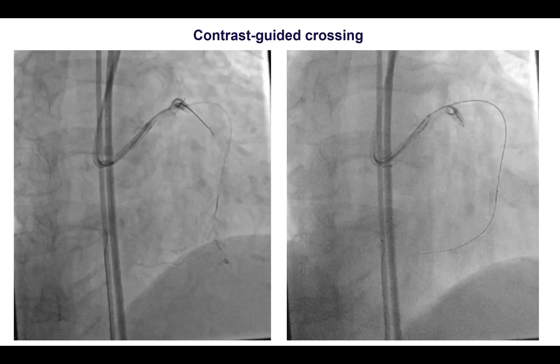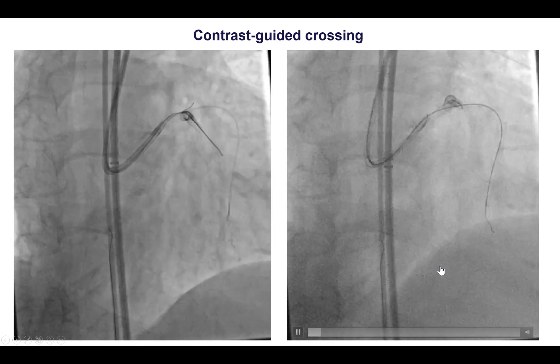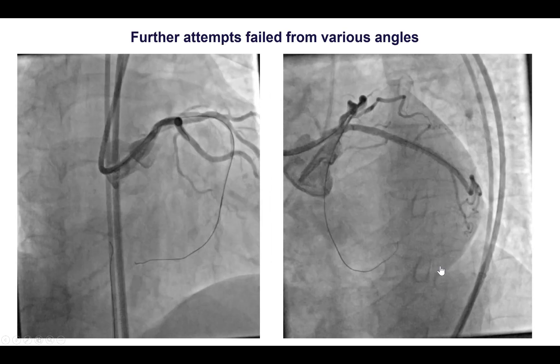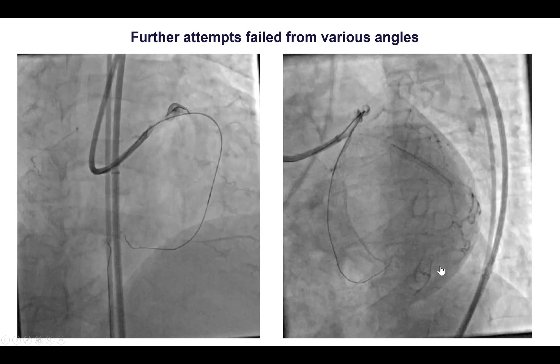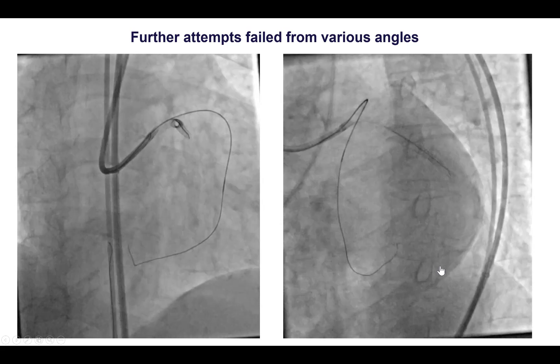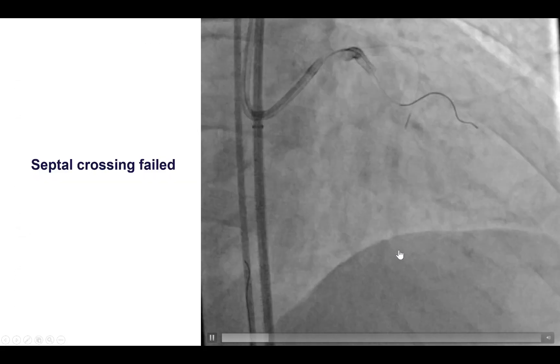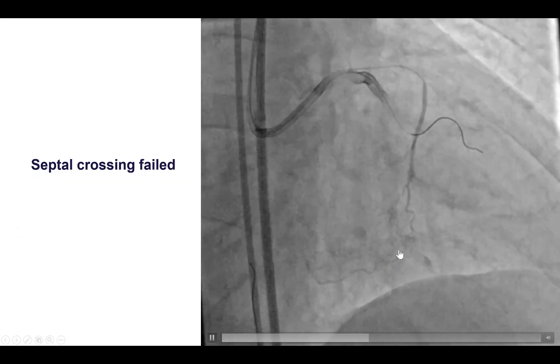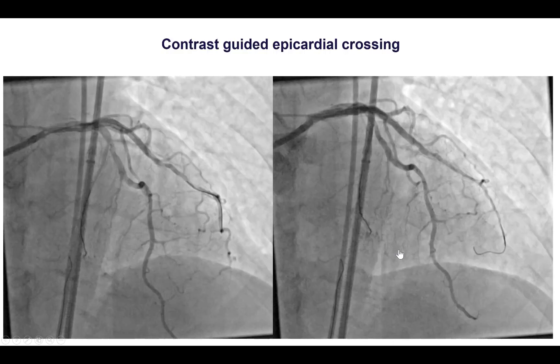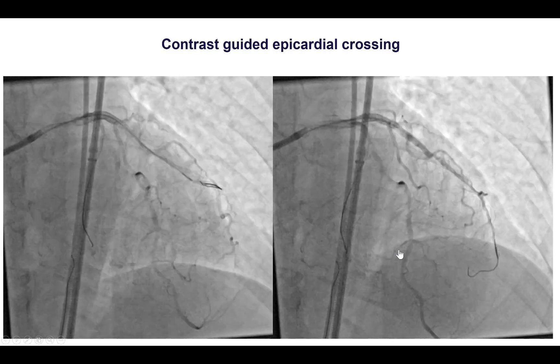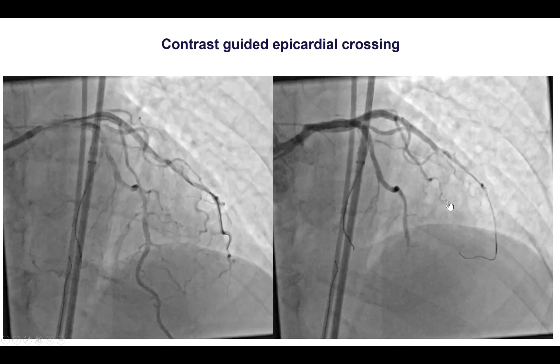We did some more contrast injections with the microcatheter, but once again we were unable to advance the retrograde guide wire. We tried different angles — sometimes the LAO view can help across the septal collaterals, but even in the LAO view we were not successful. So we failed to cross the septal collateral, and that is why we decided to go with retrograde crossing through the epicardial collateral from the first obtuse marginal branch.